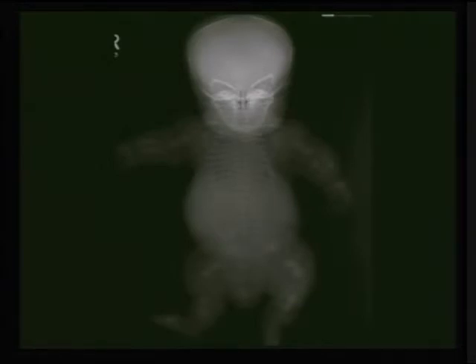Thanatophoric dysplasia. The specific thing about this is that you can look at the vertebrae. The vertebrae have a specific shape, H-type vertebrae. And if you look at the long tubular bones, they are no longer long. All the achondroplasia are short. All the babies with achondroplasia are short. If you look at the long tubular bones, it looks like the receiver of the old French telephone. And this is thanatophoric dysplasia.